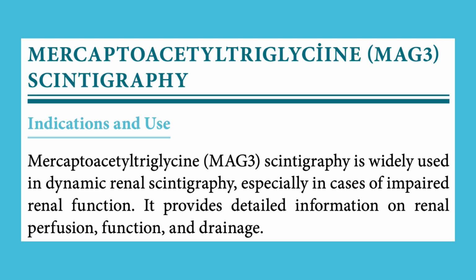Mercaptoacetyltriglycine, MAG3 Scintigraphy. Indications and use. Mercaptoacetyltriglycine, MAG3 scintigraphy is widely used in dynamic renal scintigraphy, especially in cases of impaired renal function. It provides detailed information on renal perfusion, function, and drainage.